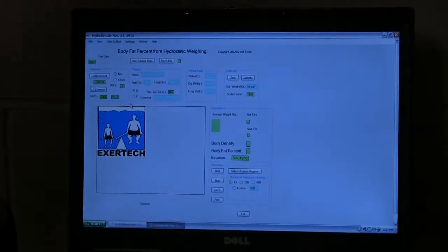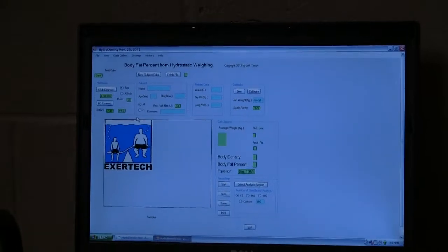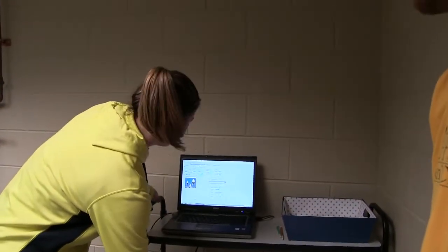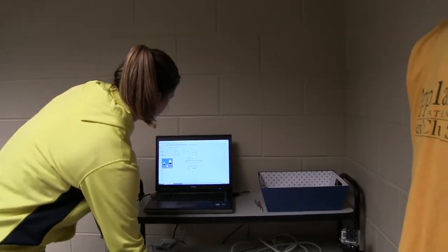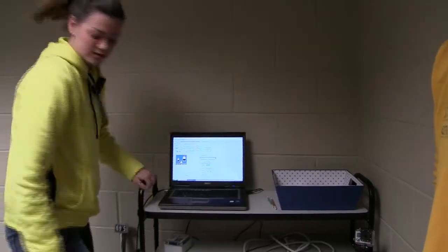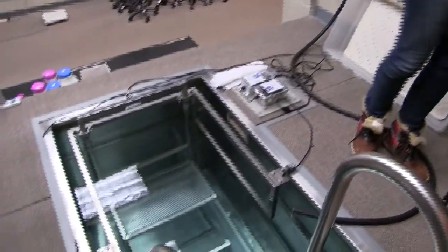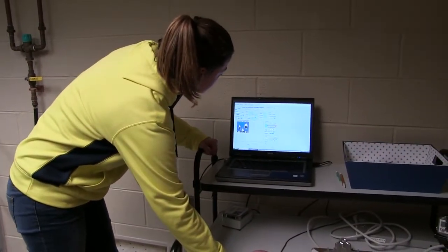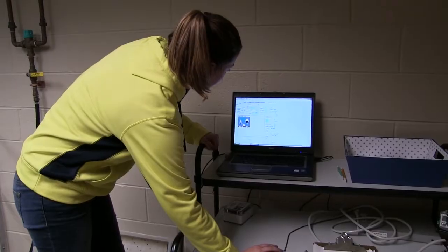Then LC connect — that just means everything is running. Now to calibrate it, we hit 'zero' and it says the platform must be empty with no calibration weights. You can see there's nothing on the platform right now, so we say okay. The zero calibration is performed, and now we move on to calibrate with the weight.